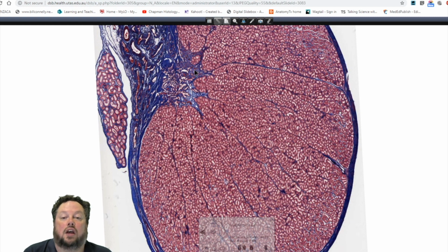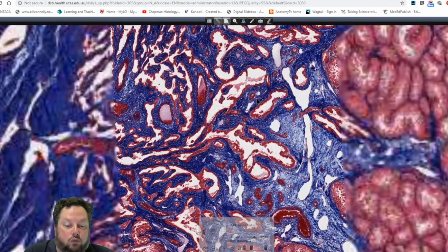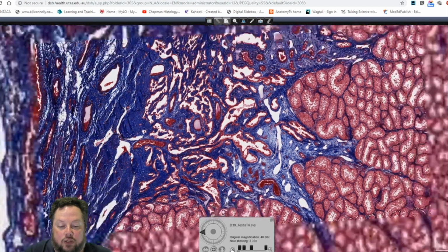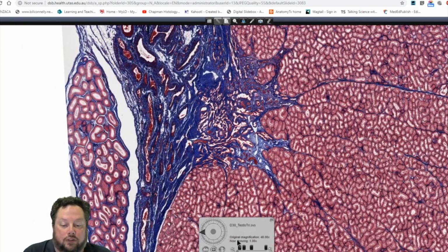This is known as the mediastinum of the testis. And housed within it are these little tears, and these actually look like little tears in the connective tissue. But in fact, when we zoom in, we can actually see that this red here is an epithelium. It's lined by an epithelium. So this is part of the intratesticular ducts known as the Rete testis, R-E-T-E testis. And it's part of the intratesticular duct system. And we'll talk about what's going on here in a little while.